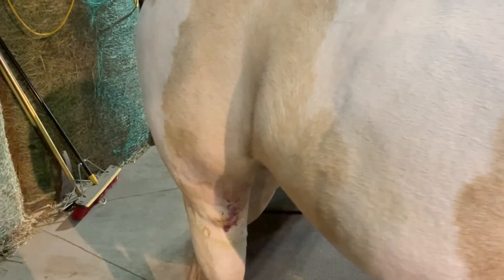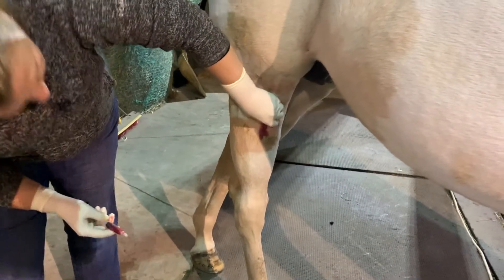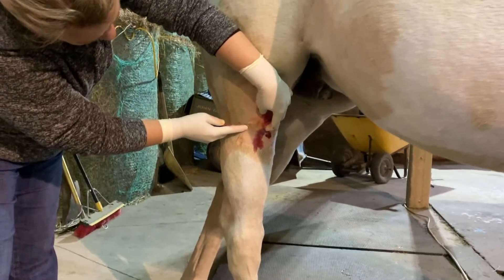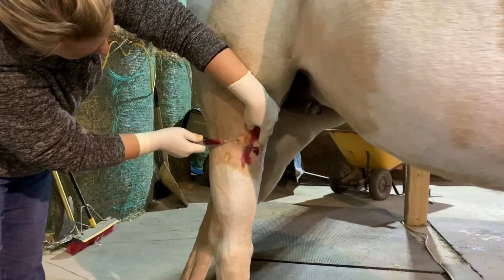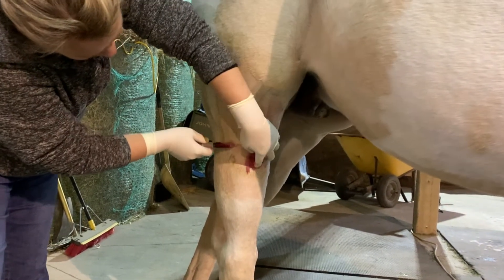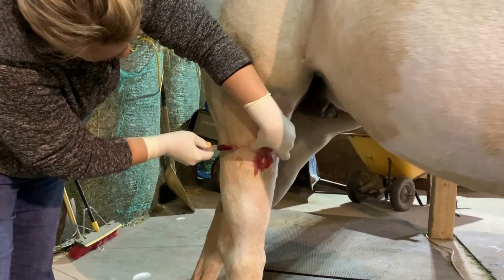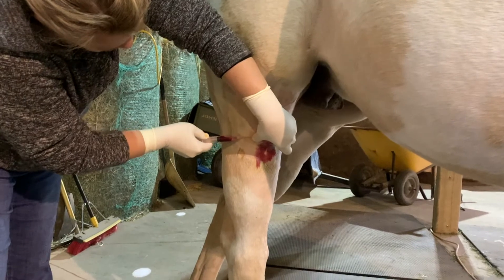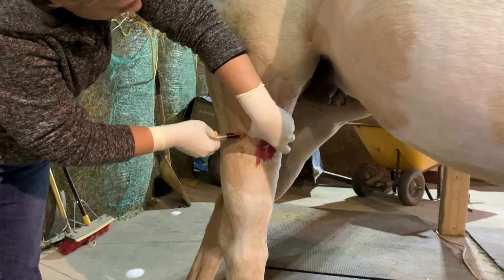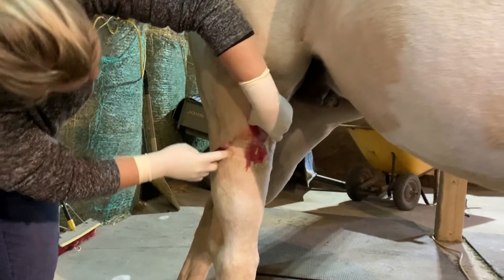Now I'm going to inject this. It impedes her movement — she can't extend this stifle very well. If you see that long scar, I'm actually going to inject down the scar line to see if I can get some of this to remodel. She tore off the whole front of her muscles in an accident. I'm still doing this sterilely, hoping I can get some of this muscle to remodel too.